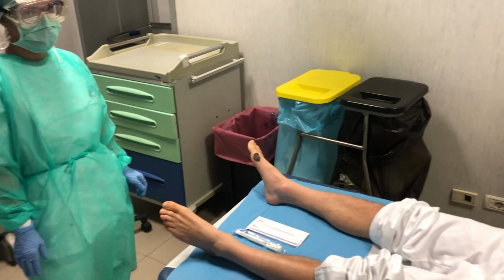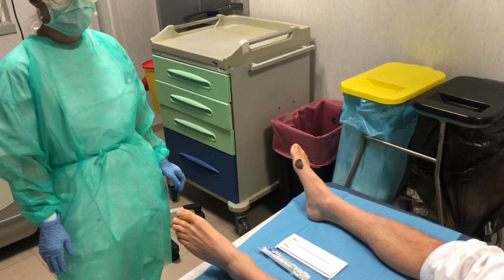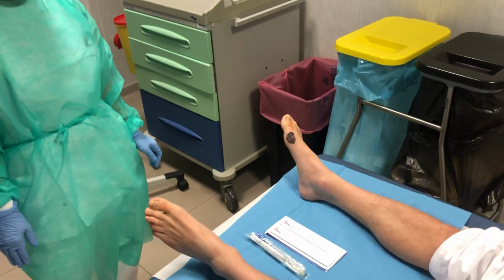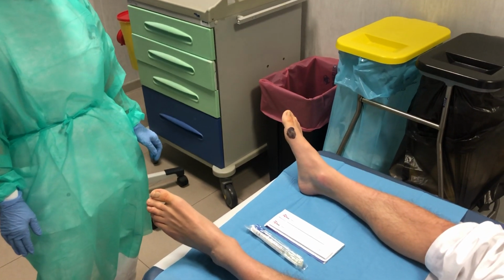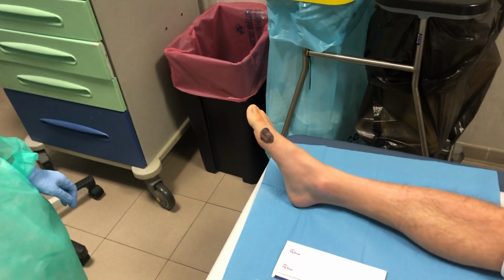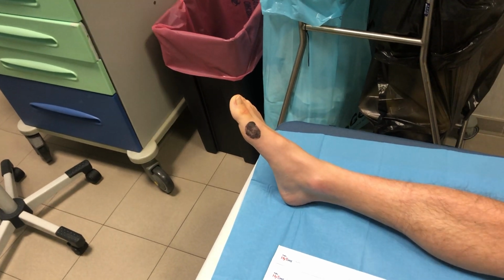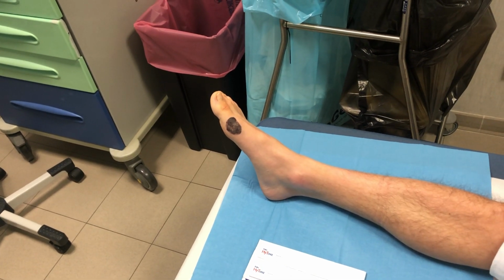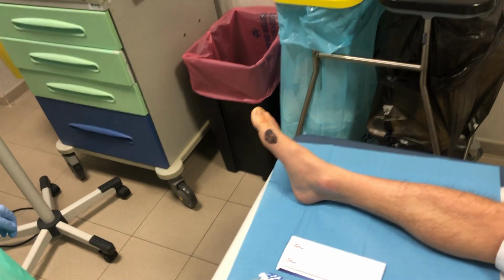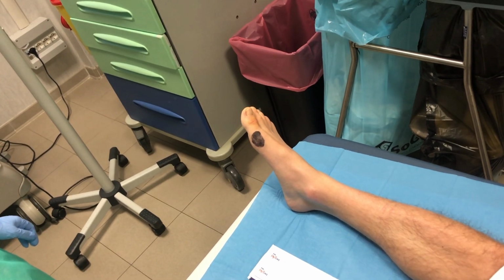We simulated a lesion on the first metatarsal head, and now we want to get a proper imaging of the lesion that we suppose has been debrided before. So the lesion should be completely inside the photograph, and we could also have the anatomic district of the lesion included in the photograph, because the surrounding skin and surrounding condition of the foot in this case have to be recorded.